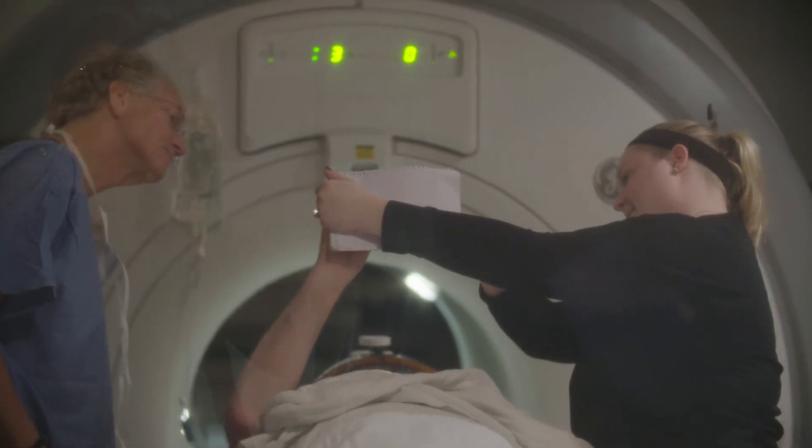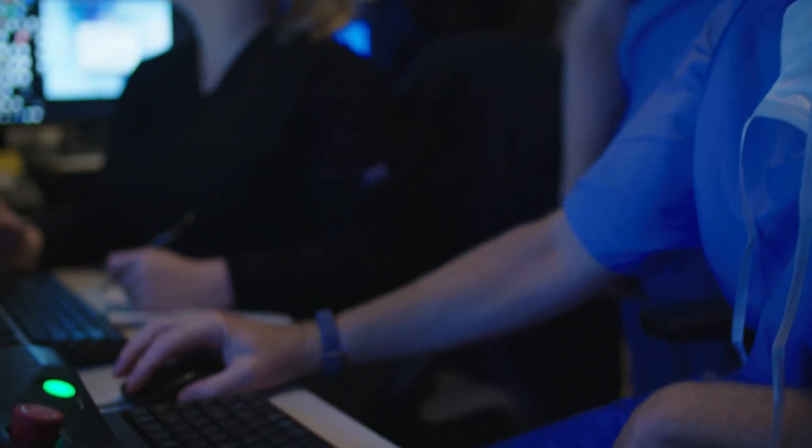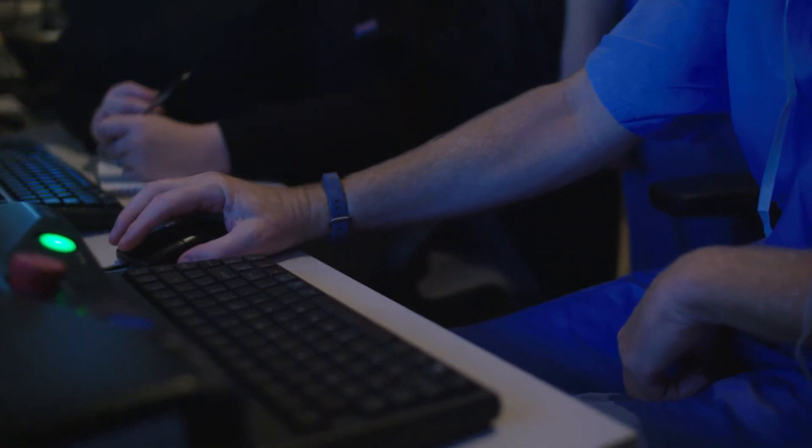Focused beam ultrasound is non-invasive and although it is not risk-free, it does not involve any hardware and it could potentially be done as an outpatient procedure.